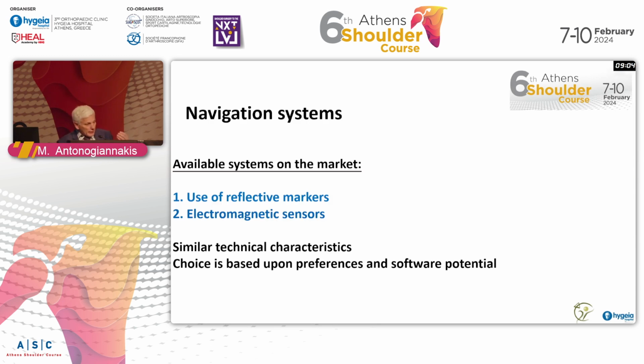And the reflective markers of the optical systems are very good, but they are cumbersome, they are huge, and they take up space in the operating theater. And the electromagnetic sensors are very sensitive to ferromagnetic instruments. So we had to use non-ferromagnetic instruments and change our instrumentation during the operation.